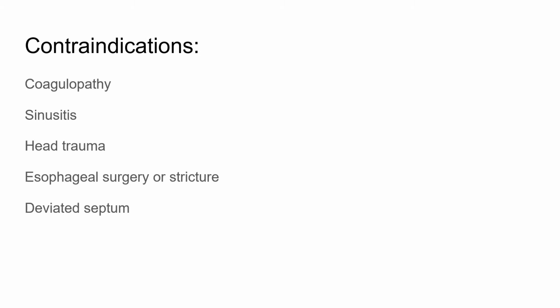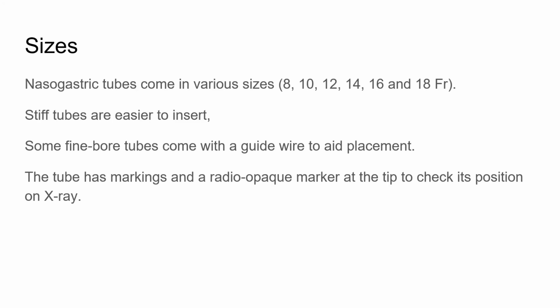So contraindications: coagulopathies, sinusitis, head trauma, esophageal surgery or stricture, or deviated septum. In these conditions, there may be a chance that it may cause trauma to the system. For the same reason, it is contraindicated.